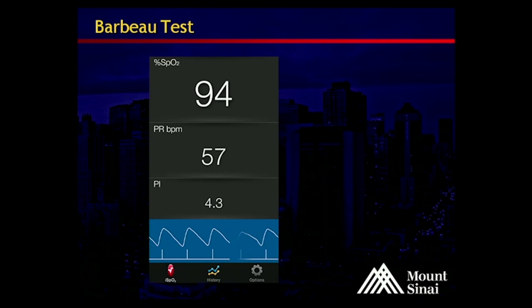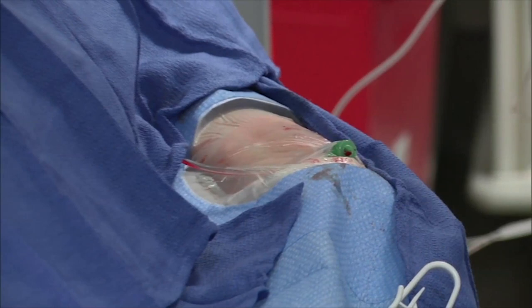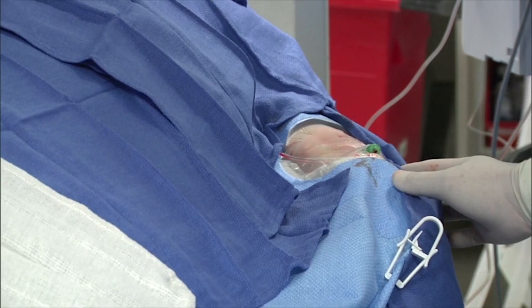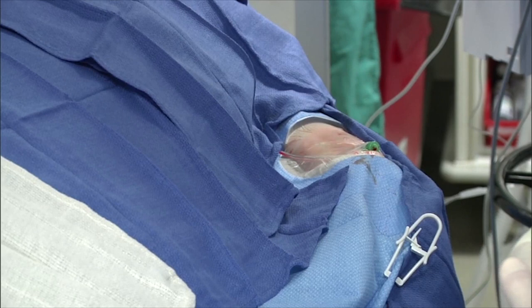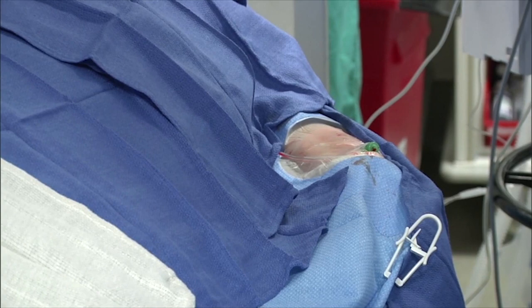Prior to the procedure we performed a Barbeau test using a portable iPhone pulse oximeter app. She has a Barbeau A result, which is quite suitable for radial access. The arm is positioned to the side using a towel as a rest. We've accessed the left radial artery using a Glide Sheath Slender — chosen because we're likely using a 5 French diagnostic catheter but want the option of a 6 French guide catheter if needed. The arm is positioned as close to the patient as possible.